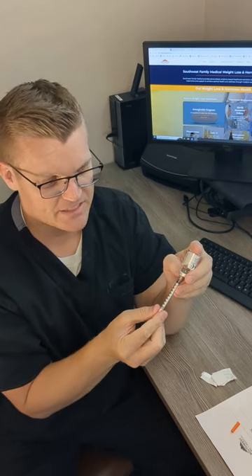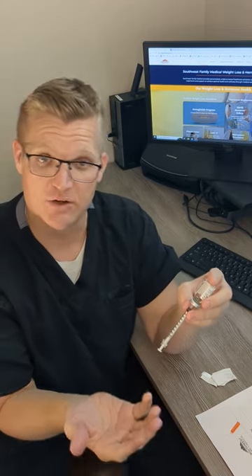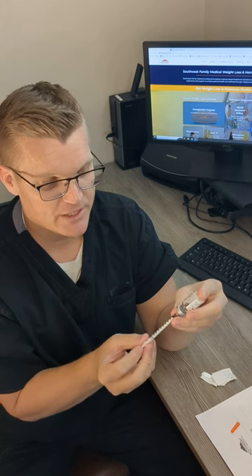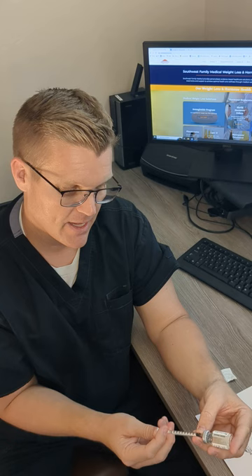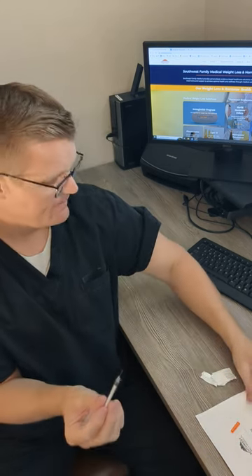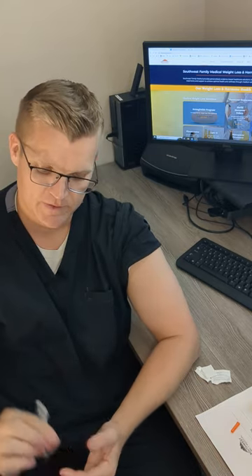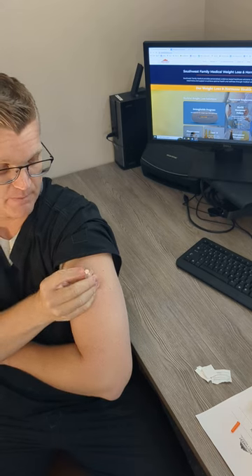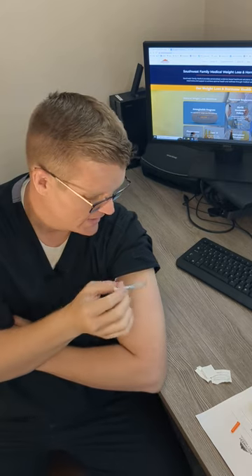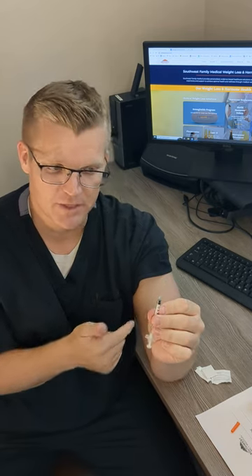I'm practicing on this video with testosterone and not the actual semaglutide. To recap: you clean the site, pull back to the desired prescribed amount — very simple. I'm going to do my injection today with you so you can see it. I'll pull that back — it's testosterone, so it takes a bit — then push back up a little. I'll take that wipe again and swipe it down. You can use one hand with a finger like this, and the needle is so small. It's literally just like that — done. Some people watching with a medical background might say it didn't go into the muscle, but that's okay — testosterone will still be absorbed, and for semaglutide we want it subcutaneous anyway.